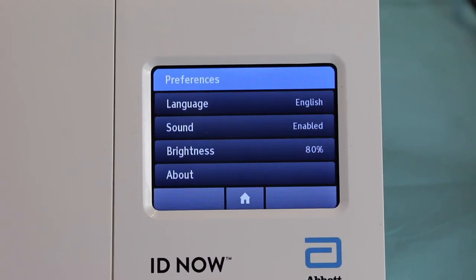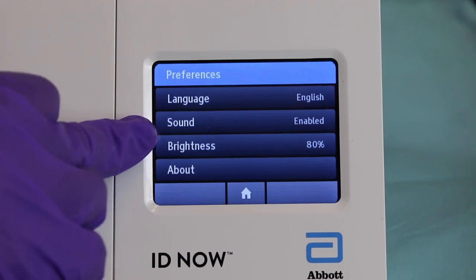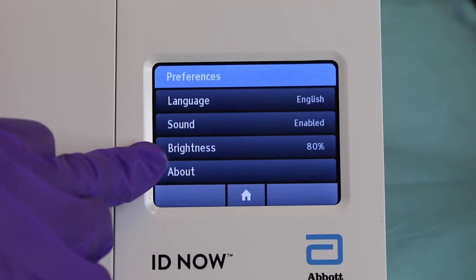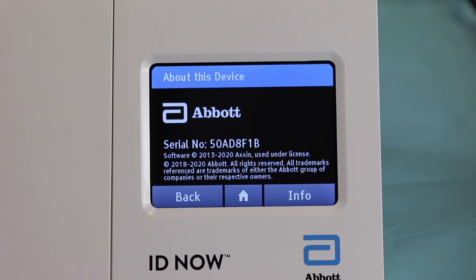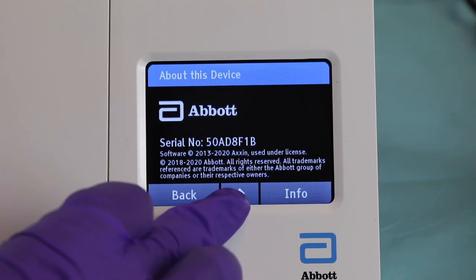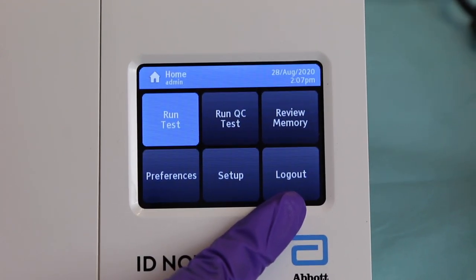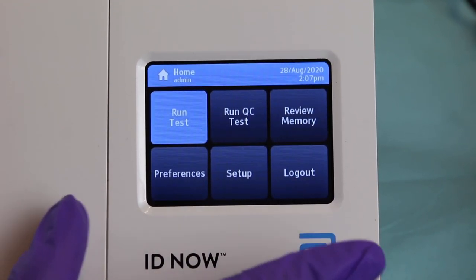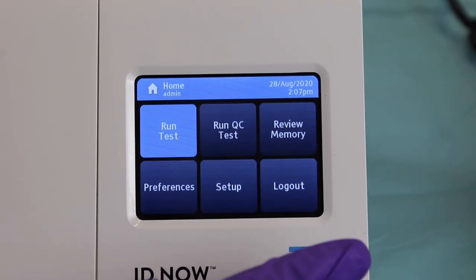Preferences allows you to change the language, the sound — that beeping noise — and the brightness. If you hit 'About', it will tell you more about the machine, giving you the serial number and similar information. The logout option is rarely used because you do not have to turn off these machines unless the machine is being taken somewhere else. You can keep the machine plugged in and leave it on.